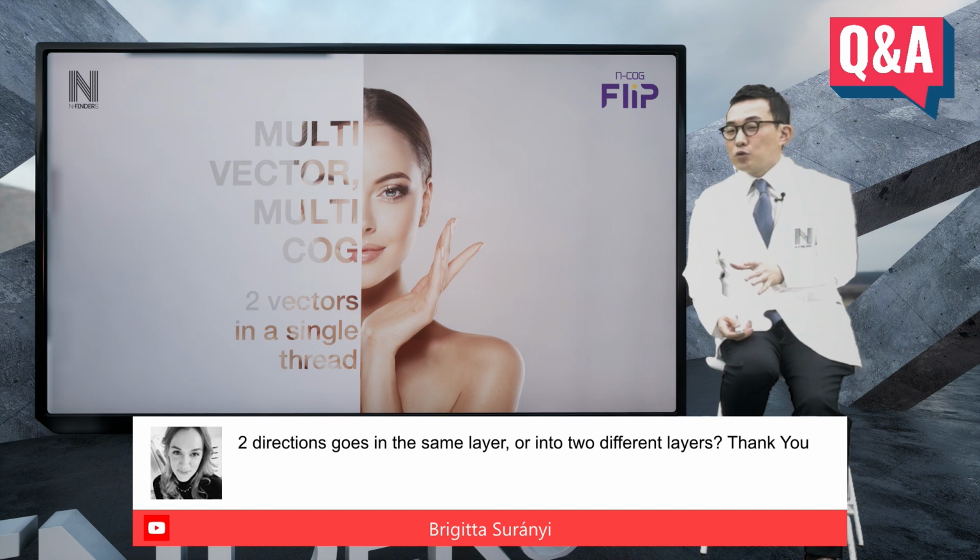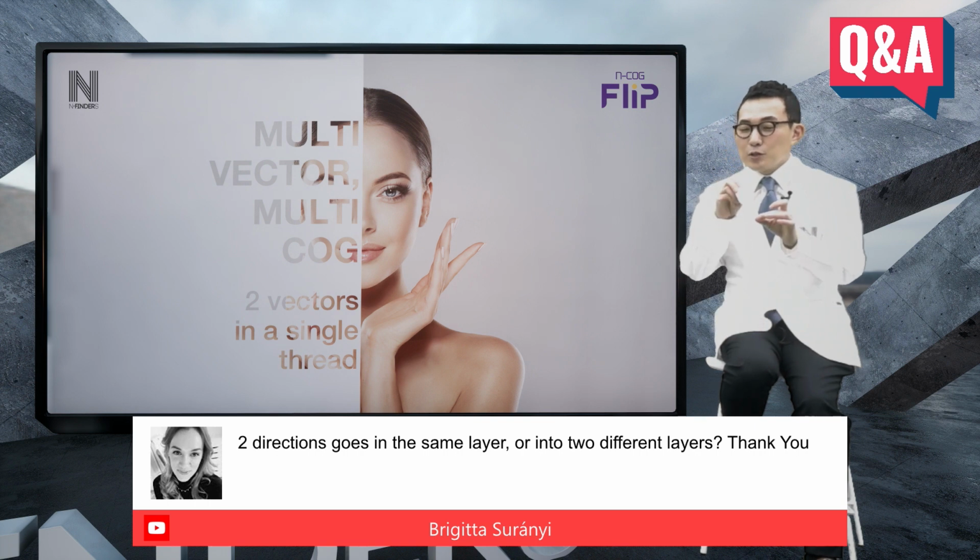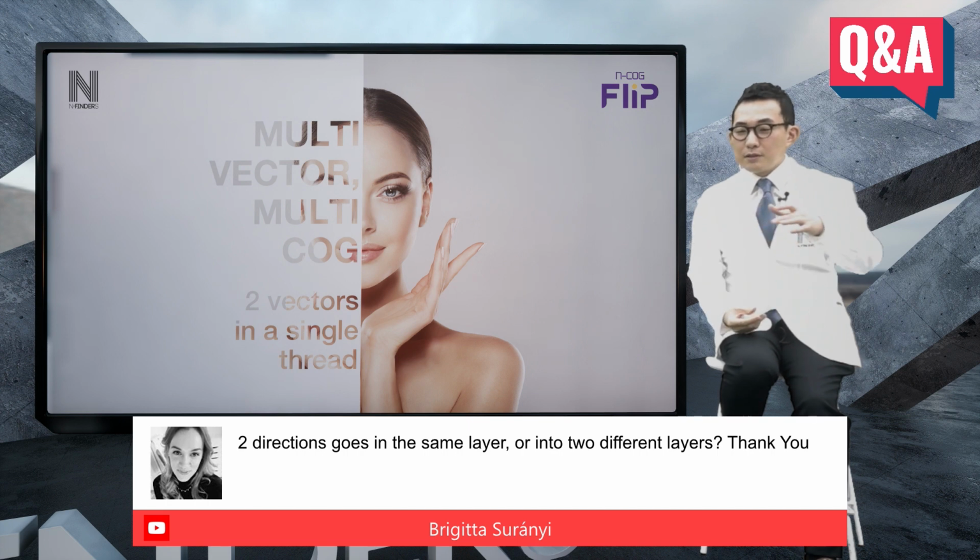But I want to note that the second thread, the flipping thread, is shorter than the original first thread. So if the second thread is shallower, then sometimes the end of the thread can touch the skin. So when you flip and reinsert, go deeper than the first thread. Very good.